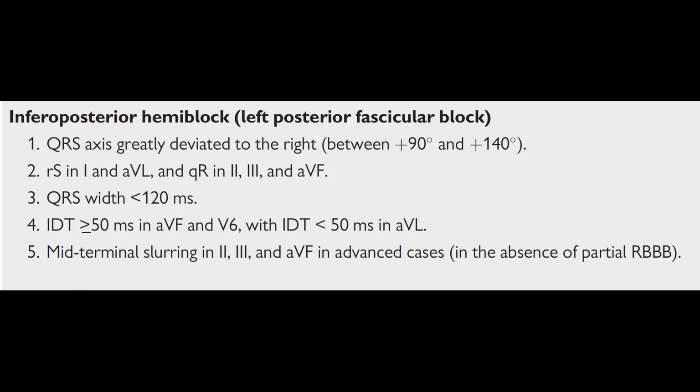I add the ECG criteria of left posterior fascicular block one more time, just for visual memory stimulation.